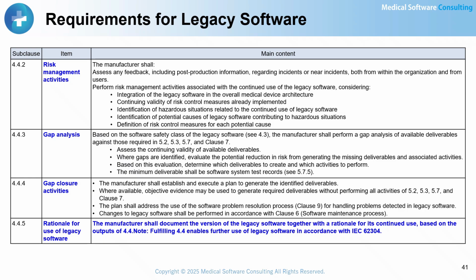Clause 4.4.5, Rationale for use of legacy software. Finally, manufacturers must document the version of the legacy software together with a clear rationale for its continued use.